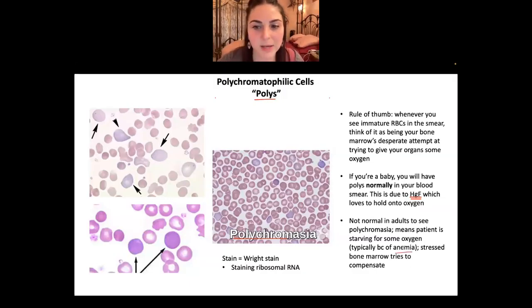Usually it's some sort of anemia. Again, this is not heme block. You're not learning the anemias, but I just wanted you to be aware of this. It's like a precursor for next year. And we're going to talk about another type of cell, which is the exact same cell. It just differs by the stain. Again, don't memorize these stains, but for next year, it's here for you.